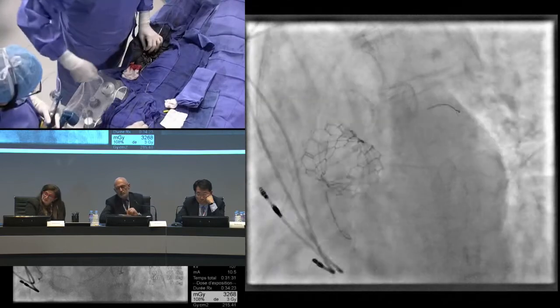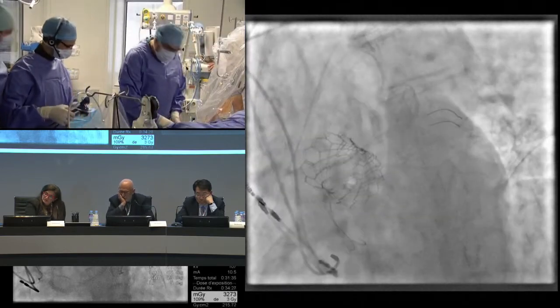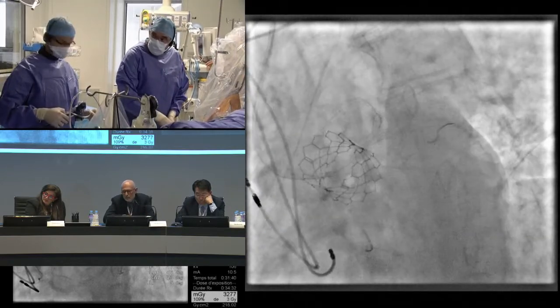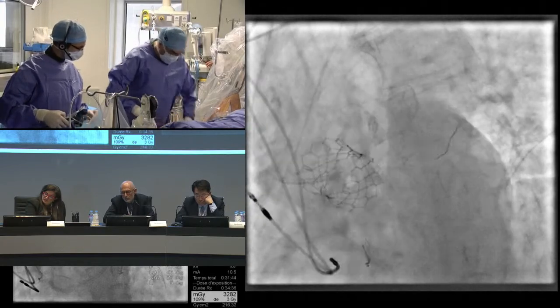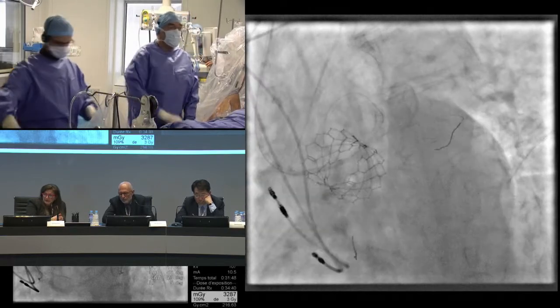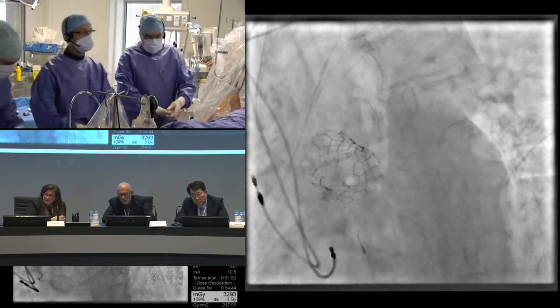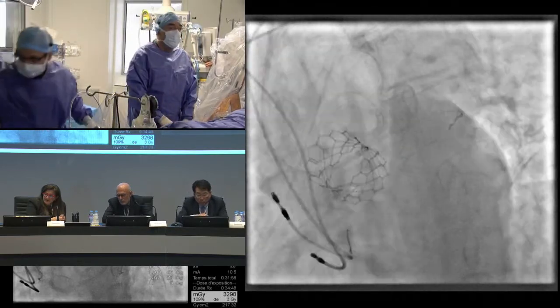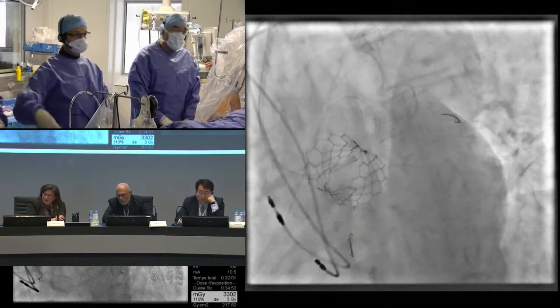Donc 5 millimeters by 10. So 5 millimeter balloon by 12, if you have a 12. If you have a 15, we will place the balloon inside the aorta, no problem. Do you think your stent is well dilated after the bifurcation, the LAD stent? Do you think that needs any more post-dilatation, the LAD stent after the bifurcation? We could come back to have, yeah.